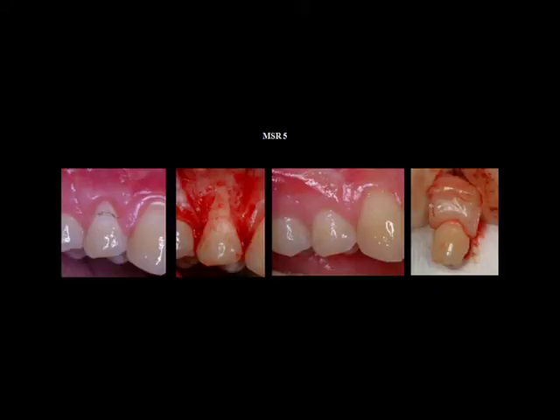Our other test case, tooth removed in block. Look at this polarized light microscopy. New bone, functionally oriented PDL, new cementum. Look at those Sharpey's fibers. You think you're going to pull that graft off of that root? There's no way. You know, that sucker's firmly bound down.